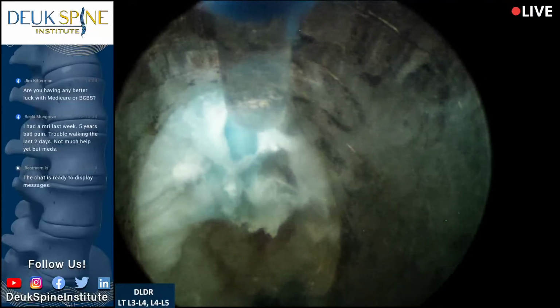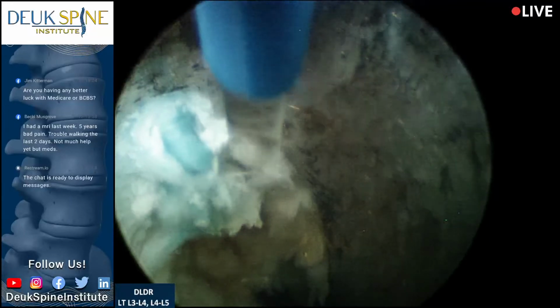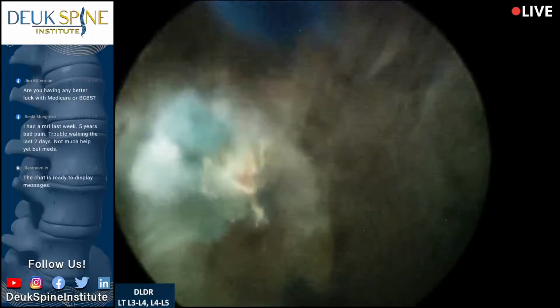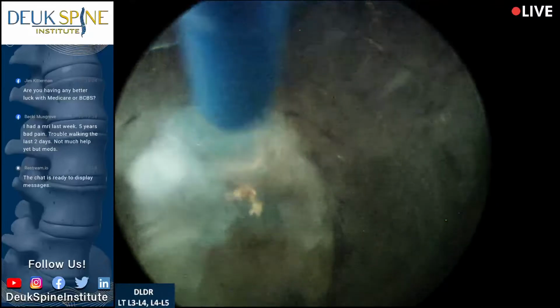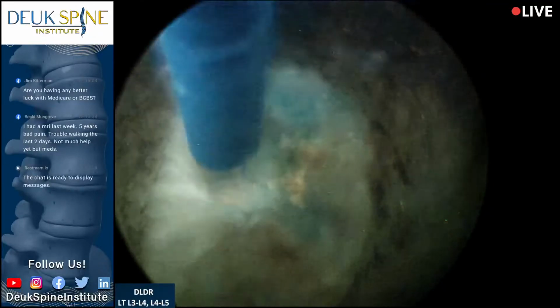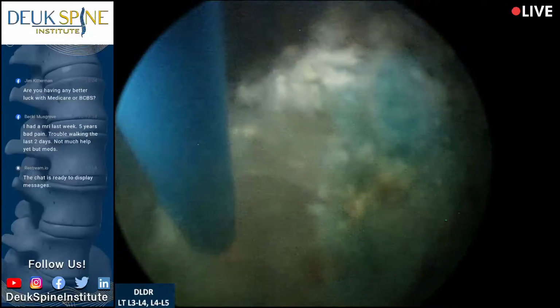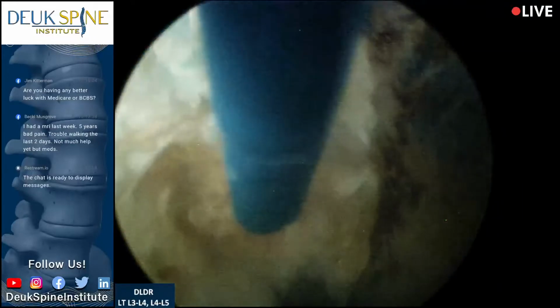Look at the tear right there. You see that? You can see the white right there separating, and the blue stuff is the herniation within the tear. That blue stuff is why this won't heal, why it causes so much pain. Your body's trying to heal the tear, but it can't because the blue stuff is stuck in there. And that's what I'm cleaning out, the blue stuff. Okay?